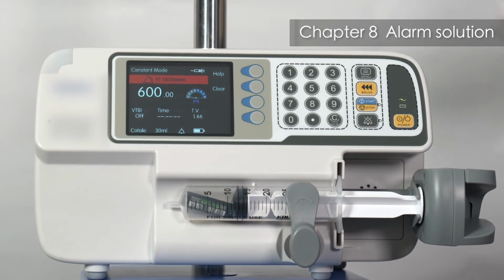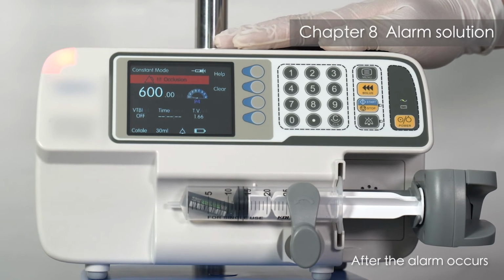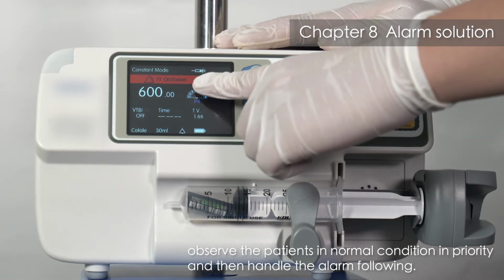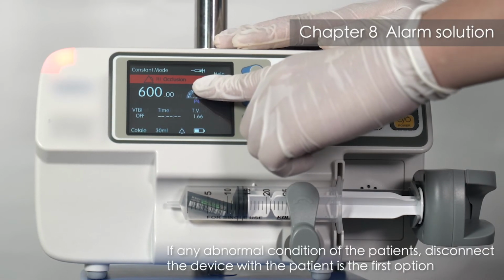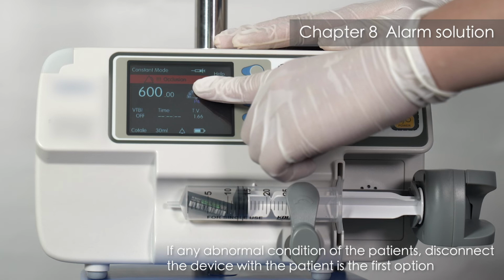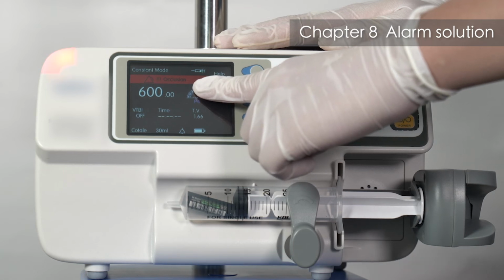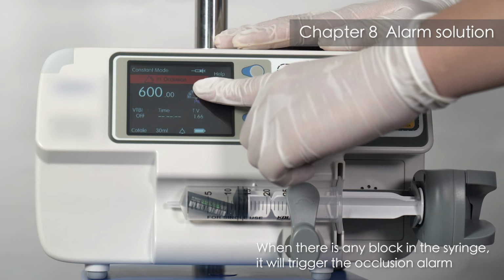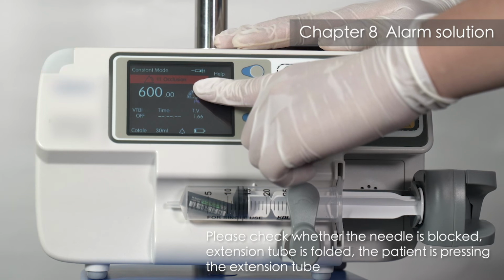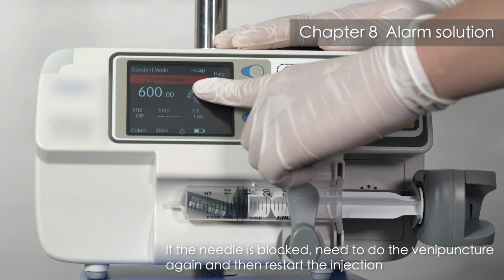Chapter 8. Alarm solution. After the alarm occurs, observe the patients in normal condition in priority and then handle the alarm following. If any abnormal condition of the patient, disconnect the device with the patient is the first option. Occlusion alarm. When there is any block in the syringe, it will trigger the occlusion alarm. Please check whether the needle is blocked. Extension tube is folded. The patient is pressing the extension tube. If the needle is blocked, need to do the venipuncture again and then restart the injection.